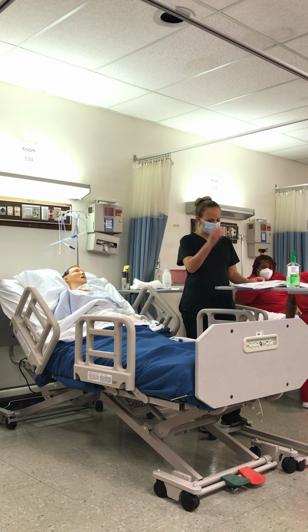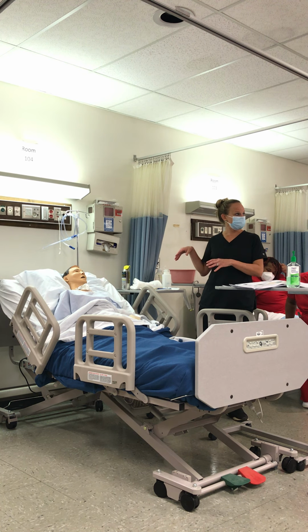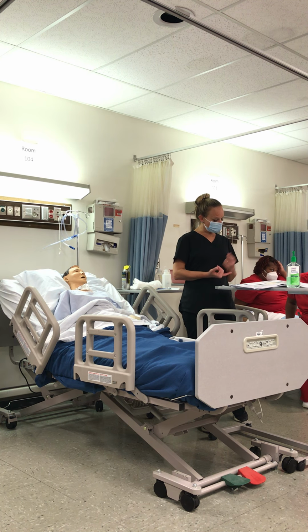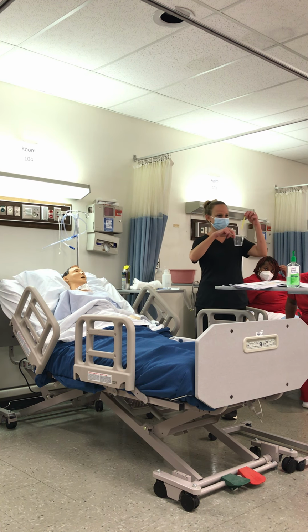And then this talks about, it's still talking about the assessment. I wouldn't do my measurements just yet. Next, I want to make sure that I personally have all my equipment together, okay? That's what I would do. I'd make sure that I have this list of things: the water, the straw. You like your straws? I'll get y'all some straws.